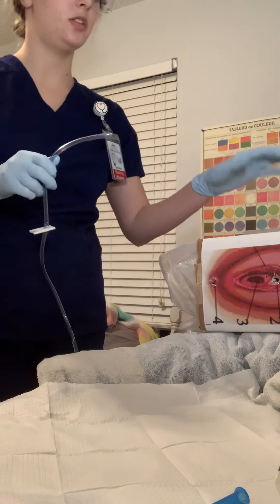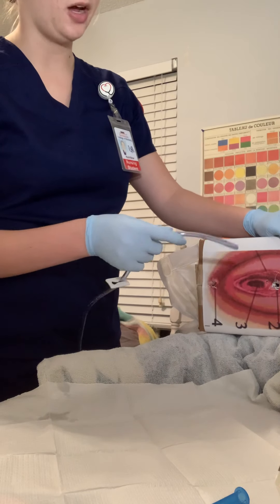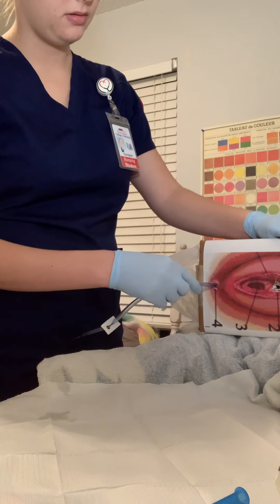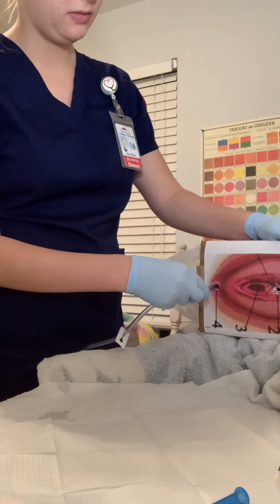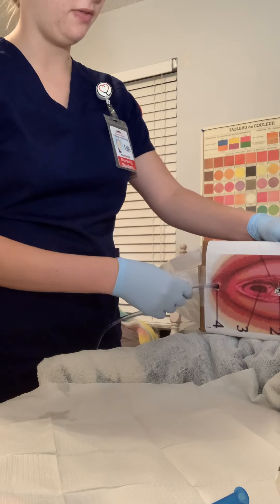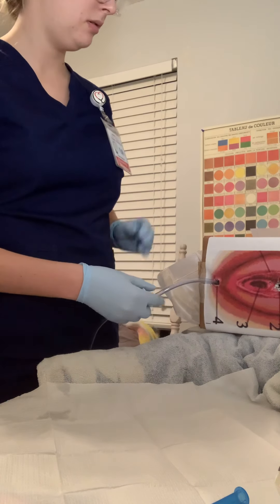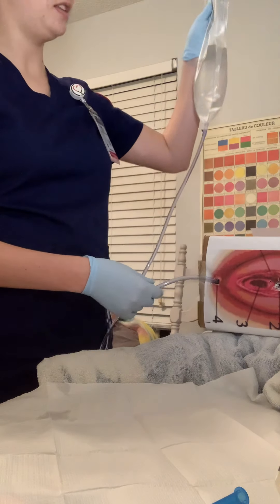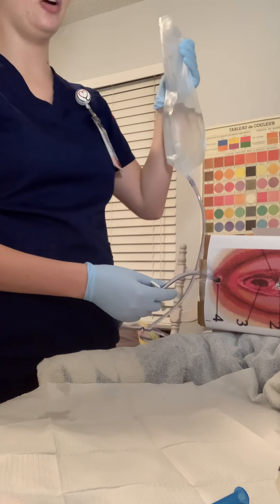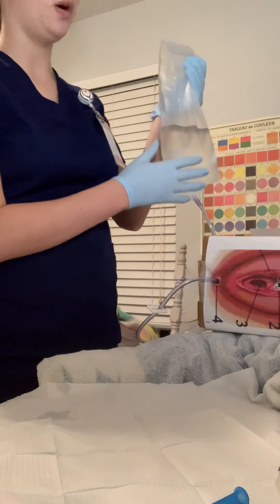I'm going to instruct my patient to take deep slow breaths. I'll spread the buttocks and insert the tubing about three to four inches. I'm going to unclamp and then raise it about 12 to 18 inches. If the patient has any cramping or discomfort, I can lower the bag or completely clamp. I'm going to let all the water drain through.